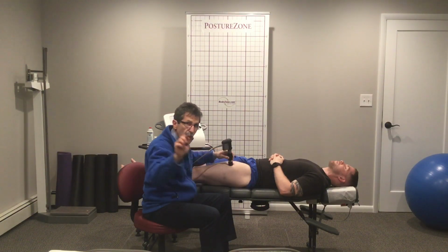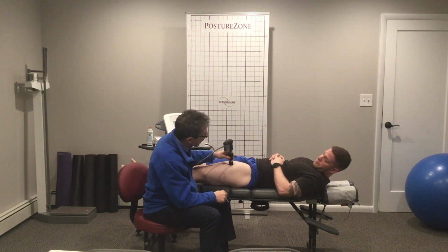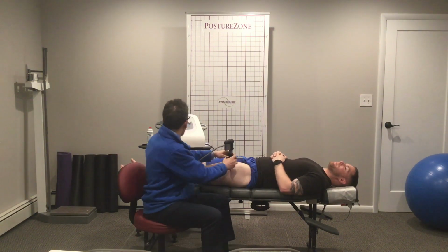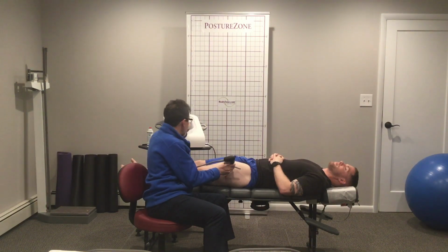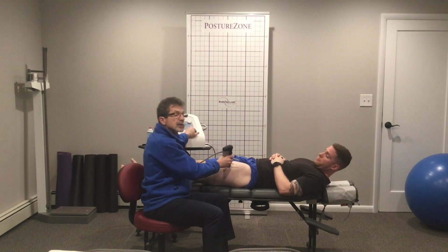Mike knows the answer, and I hope you do too. If you've seen the other videos, you know. Mike, when we're doing that, we're going over a painful spot. About how much should the pain be? 5, 6 max? Exactly, 5, 6 max. If it's over that, back off on the bars. Or go to an adjacent area. Don't go right over it. Or increase your hertz a little bit.